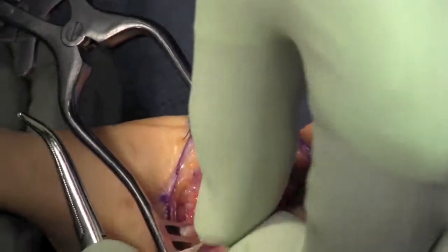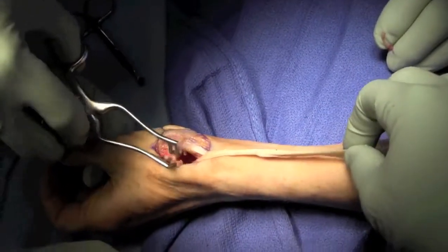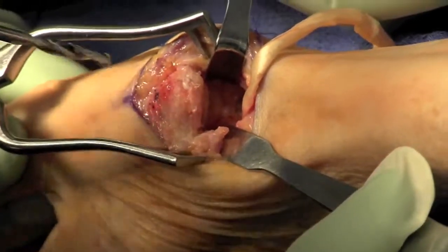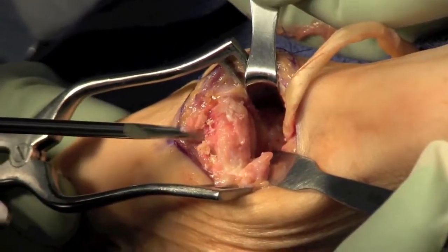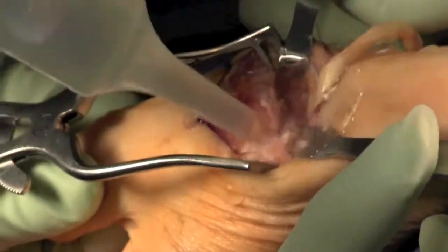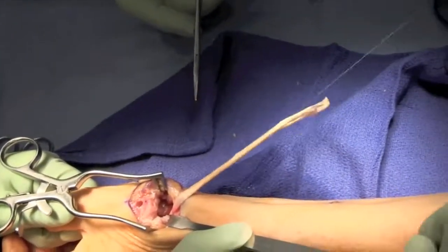The tendon is harvested and placed into the defect created by the trapezial resection. At this point we will place a drill hole through the proximal first metacarpal — either a 2.7 or 3.5 millimeter drill will be used. This is angled to exit the first metacarpal on the ulnar side, and the hole is enlarged to facilitate passing of the flexor carpi radialis.